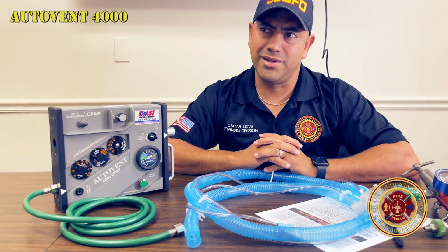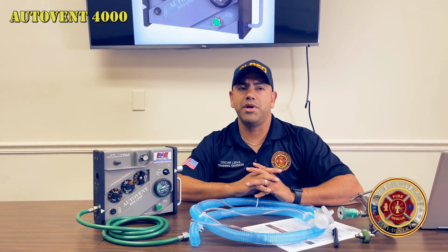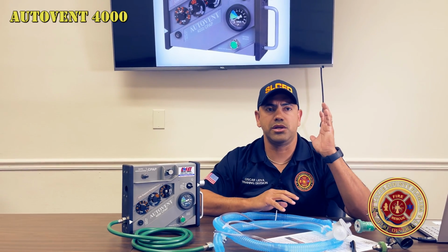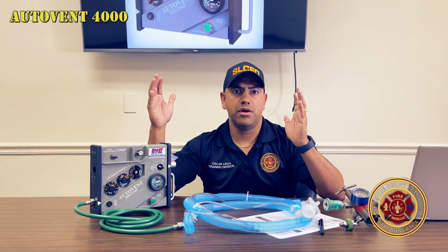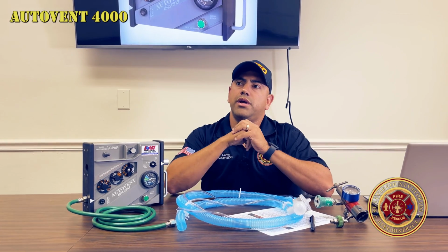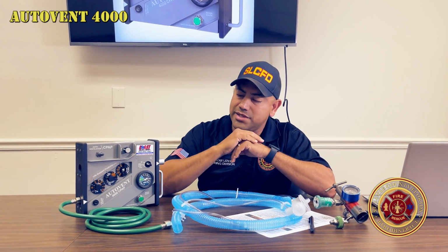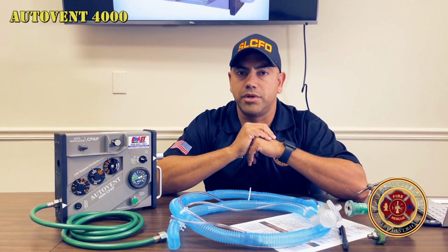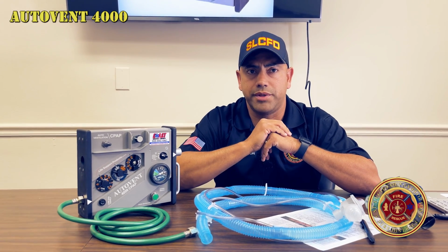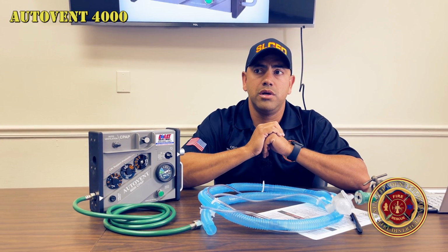As stated before, the delivery time for the adult is 2 seconds, and that is typically measured if you're delivering anywhere between 400 and 1,000 cc's of oxygen or air. All right. If it is in a child setting, the delivery time is 1 second. Remember to refer back to your procedural guidelines for the tidal volume calculations. We still use 6 to 8 mLs per kilo.